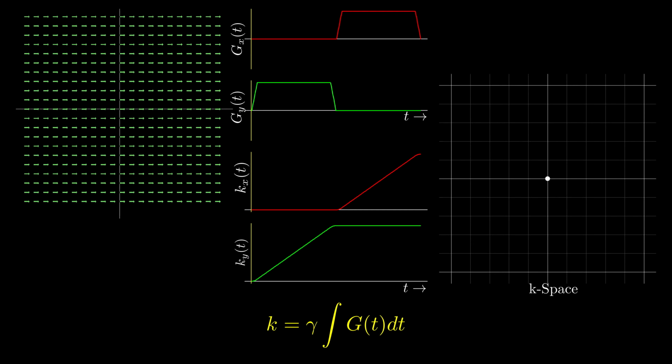We always start at the k-space origin or DC offset immediately following excitation. Then the kx, ky plots show first an increase in ky, then an increase in kx, giving this path through k-space.